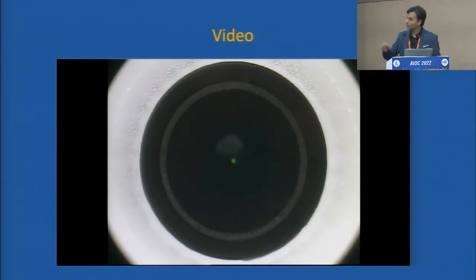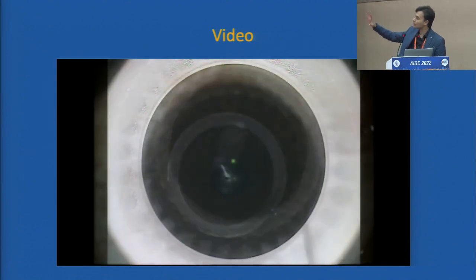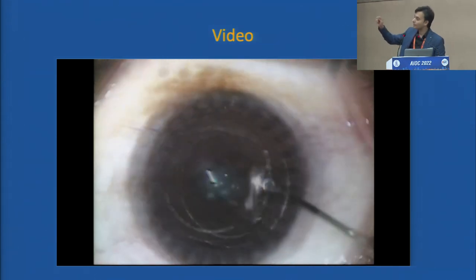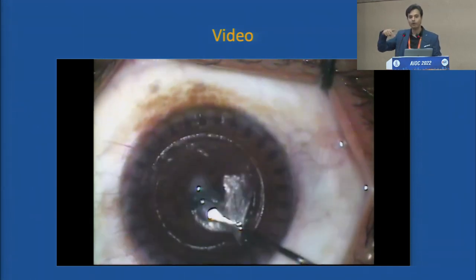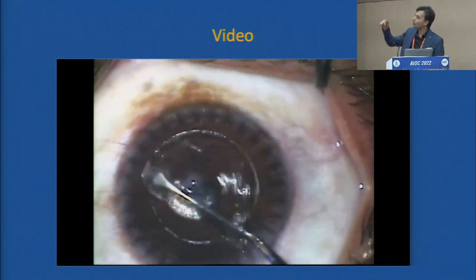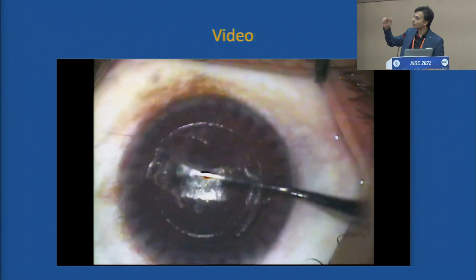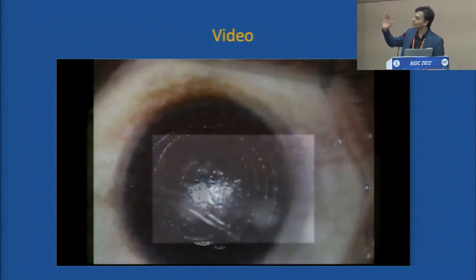Yeah. So this is the donut shape application, and there are going to be certain extra amount of pulses which are going to be fired in the periphery. So this is going to convert the smile cap into a flap. So I'm going through a new side cut, but understand that I'm going through the same interface which was created before during smile procedure. So I'm going beyond the epithelial ingrowth now. And I'm just trying to make sure that I'm not opening up the full flap. I'm just exposing the flap good enough for my epithelial ingrowth debridement.